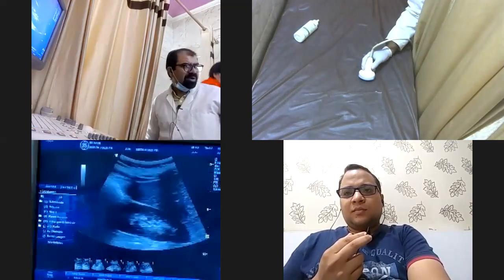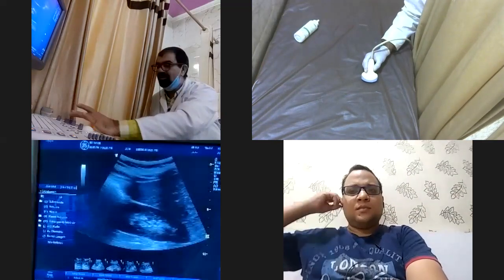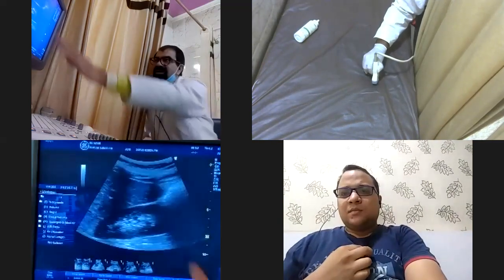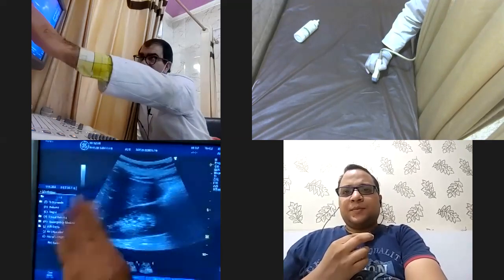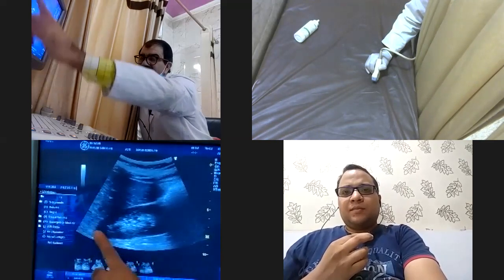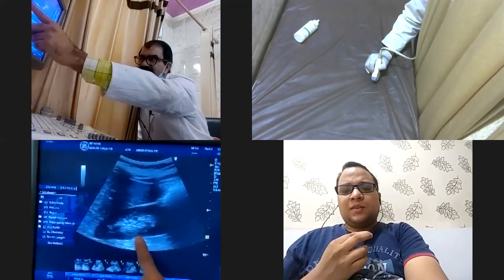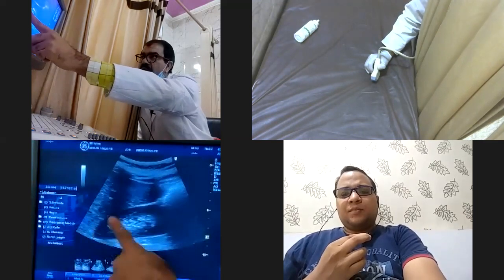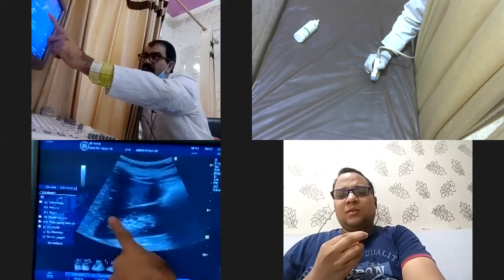Now, I was like this, and I have rotated it clockwise like this. This is the image, right? Yes, sir. Is this side superior? Yes, sir. Now see, if I know that superior is here, it means that which pole of the kidney is this? Is this the upper or the lower pole? Upper pole. And this will be the upper or lower pole? Lower pole. Why will this be the lower pole?